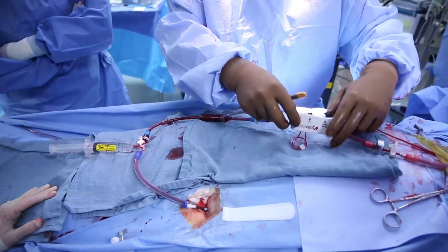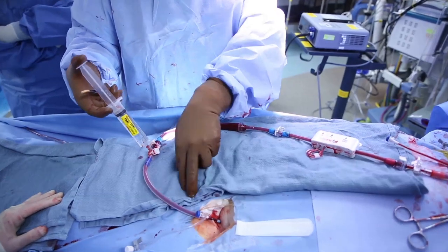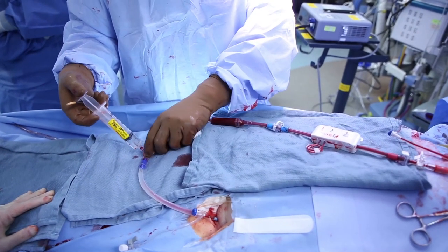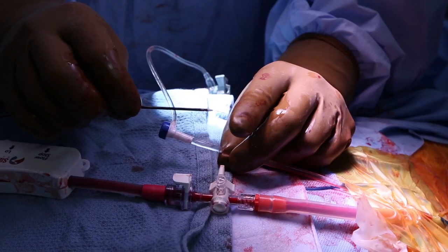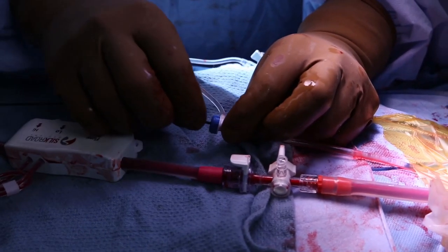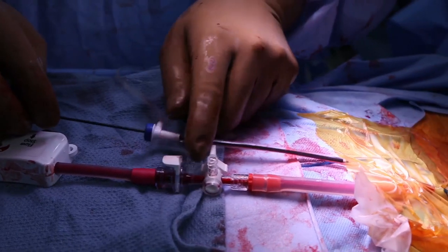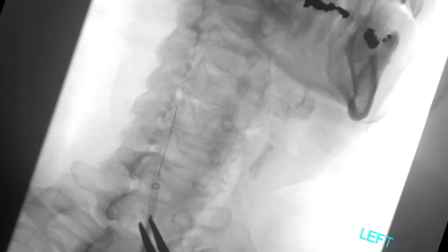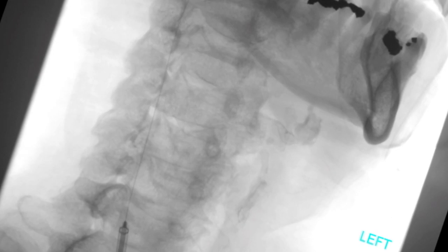An inline filter was used to prevent return of any microembolic debris into the femoral venous system. Both low and high flow settings were confirmed with injection of heparinized saline solution. A 6 to 8 mm by 40 mm carotid stent was prepped on the back table and preloaded with a 0.014-inch Asahi ProWater guide wire. A vascular bulldog was placed on the common carotid artery and institution of high flow reversal was obtained.